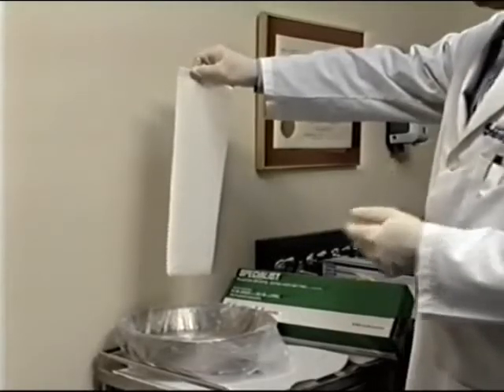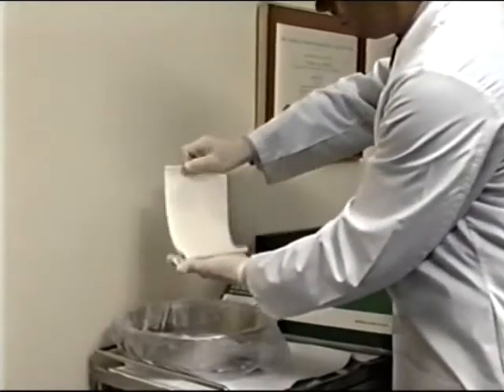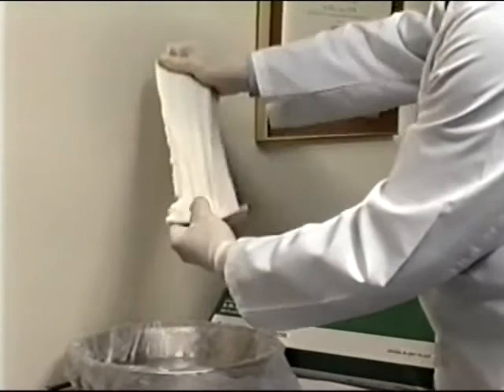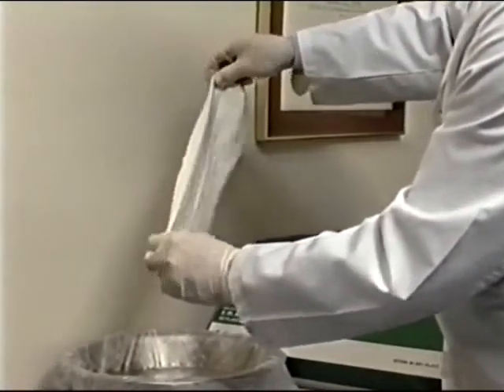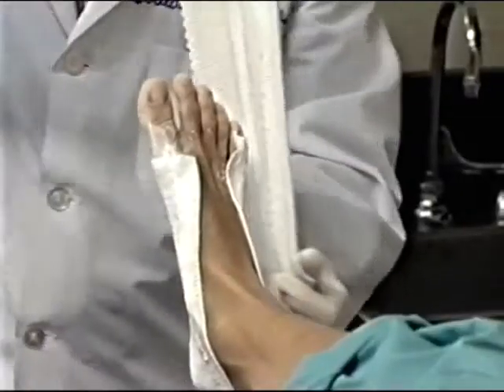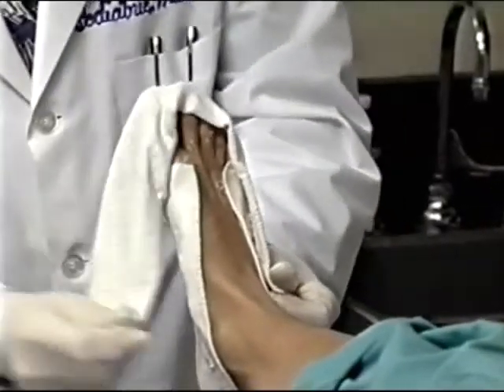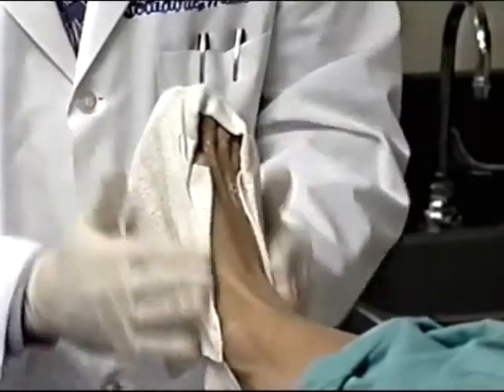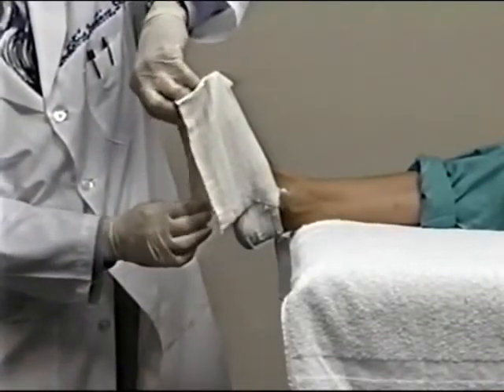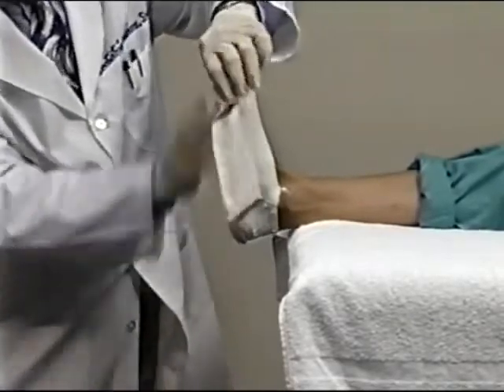Pass the second piece of plaster through the water, again allowing it to drip. Fold the plaster into your hand, squeeze it slightly, and fold the distal edge of the plaster. Drape this piece loosely over the toes without bending them. Adhere the plaster by rubbing both medially and laterally to the original splint. Tuck the lateral side under the plantar aspect and smooth the plaster.